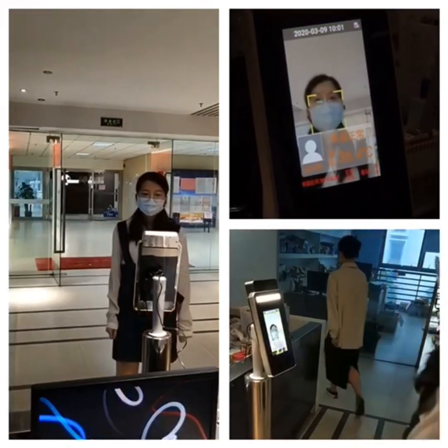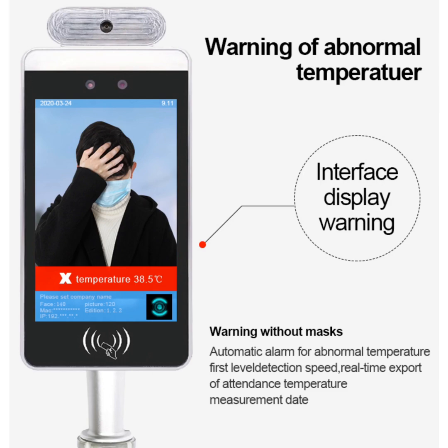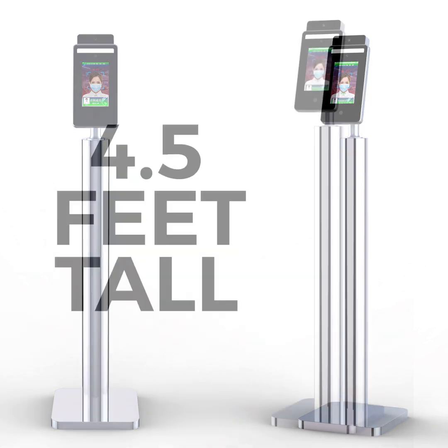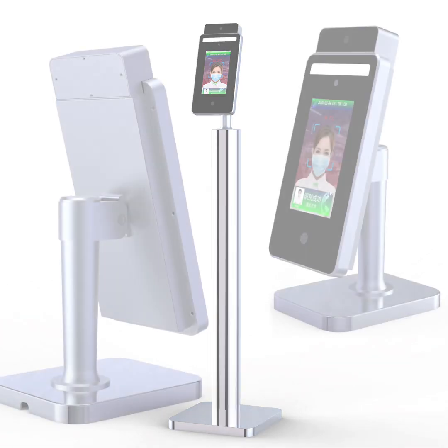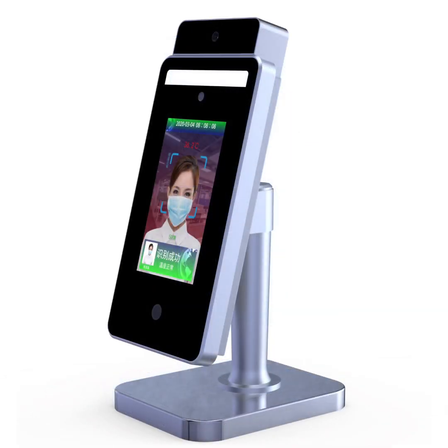This device will pay for itself in the first 30 to 45 days of being used. The coronavirus doesn't give you much opportunity to take chances or make mistakes. We can all see by Tyson and these meatpacking factories that chose not to provide PPE to their employees and chose not to make special precautionary measures like this — you've seen their doors get shut down.